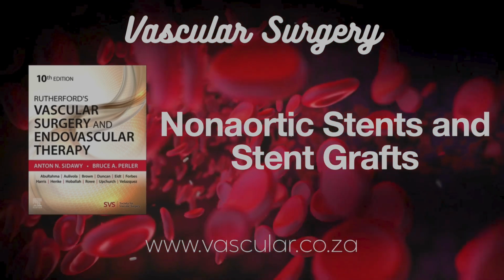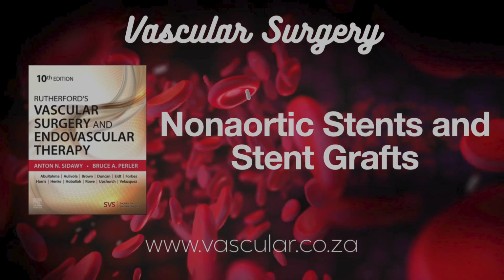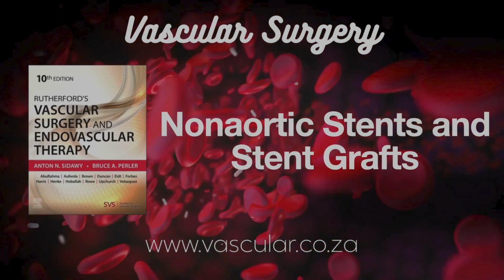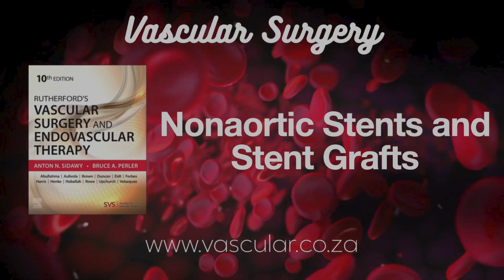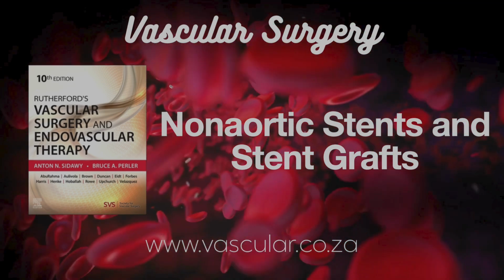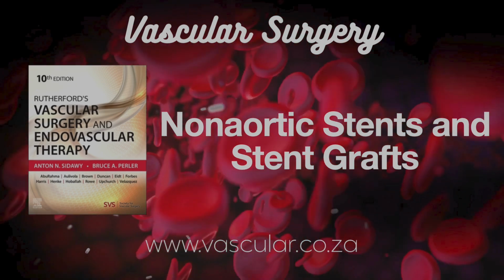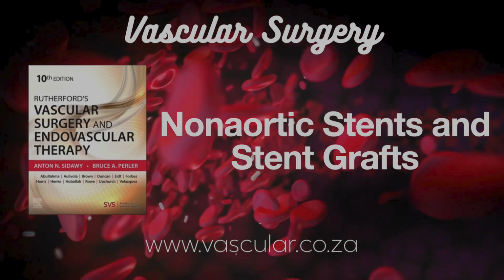Okay, one more specific location. Dialysis access veins. Ah, yes, the outflow tracts. Blockages are really common there because of the high flow and turbulence from the fistula or graft. What works best? Stenting the veins near the collarbone and upper arm seems to help the access last longer than just angioplasty. Large SE stents are usually recommended because these areas move a lot.